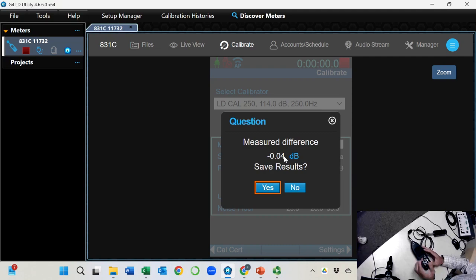So even though it's off a little bit, you can still use it by doing some adjustment within the sound level meter. Same thing for audiometer. If something is off, as long as it's not broken, you can adjust some correction table inside. Am I making sense? And that's the process of calibration.